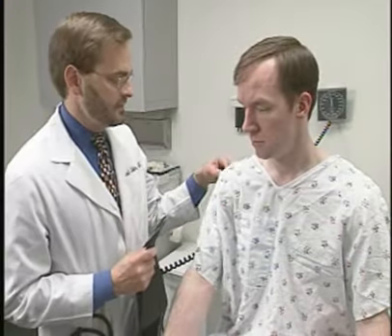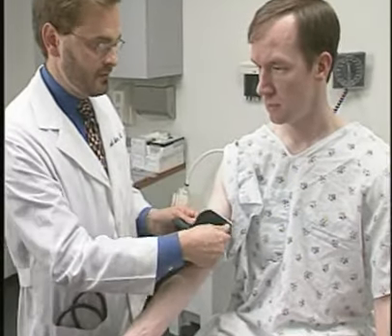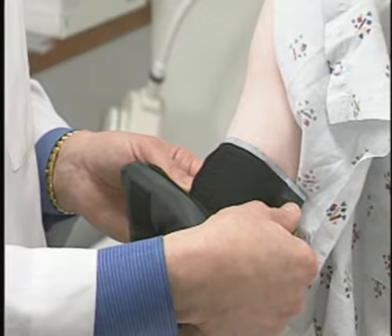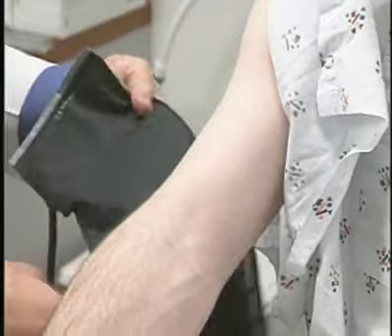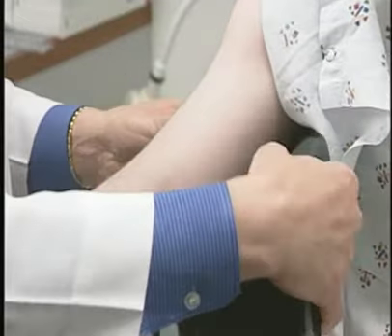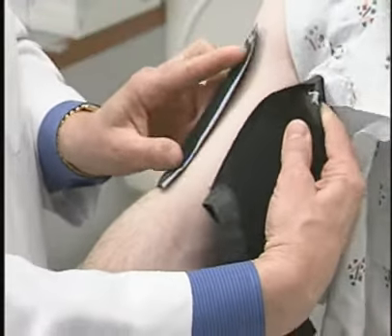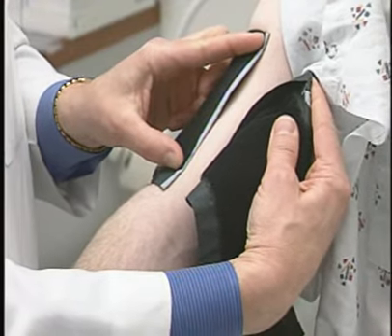To determine which cuff is appropriate, we need to measure 2 different variables on the arm. We measure the width of the blood pressure cuff against the patient's arm. The width of the blood pressure cuff should be approximately 40% of the circumference of the arm. Also, determining the total length of the bladder of the blood pressure cuff, which is where the tubes come out of the blood pressure cuff. When you wrap the blood pressure cuff around the patient's arm, it should approximately be at least 80% of the circumference of the arm.